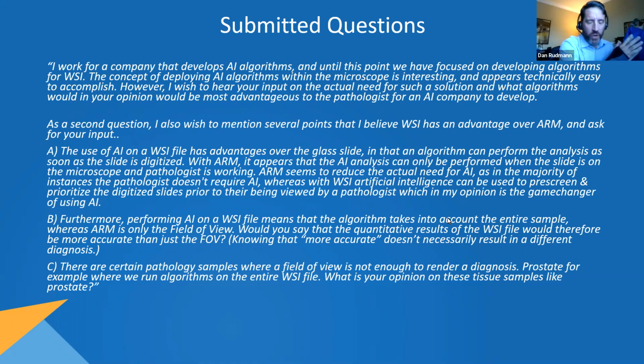Yeah, so totally in line, and it's wonderful how the preclinical space really aligns with everything that was just mentioned. So for sure, while we have whole slide imaging capabilities at some larger facilities, easy access for people to be able to tap into those, I'll be honest that in toxicologic pathology, 99% is still the glass slide.